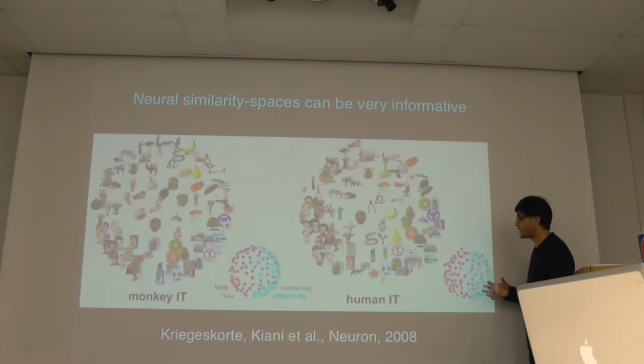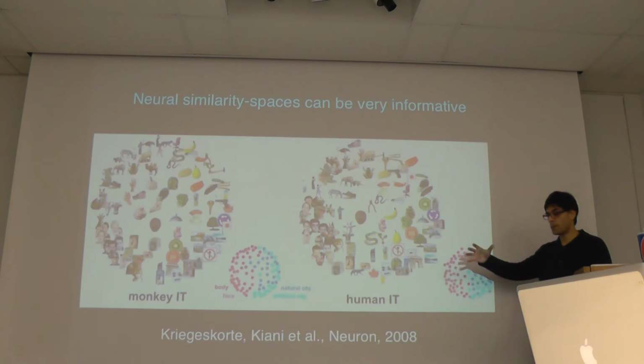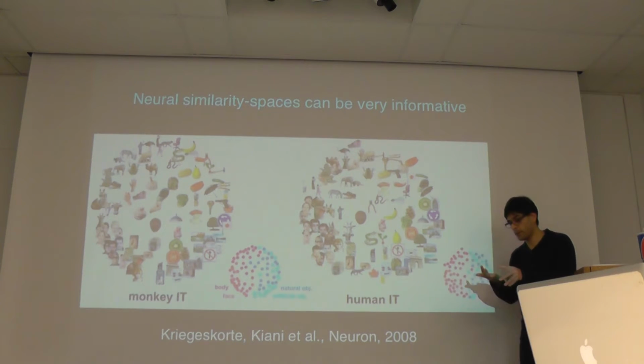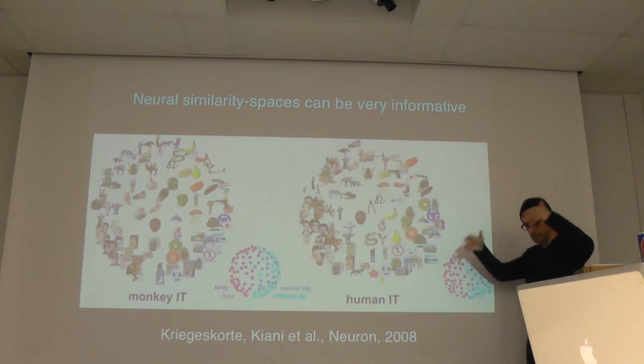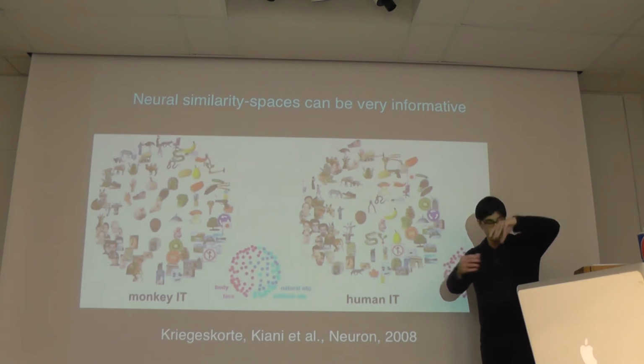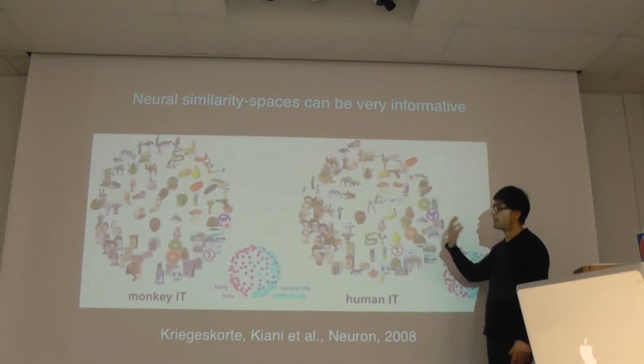This is fMRI data. This is recorded from a different species, and it's recorded in a completely different way. It's slicing the brain up into voxels, making an indirect measurement that pools over literally millions of neurons at once, and is actually just measuring blood oxygenation.